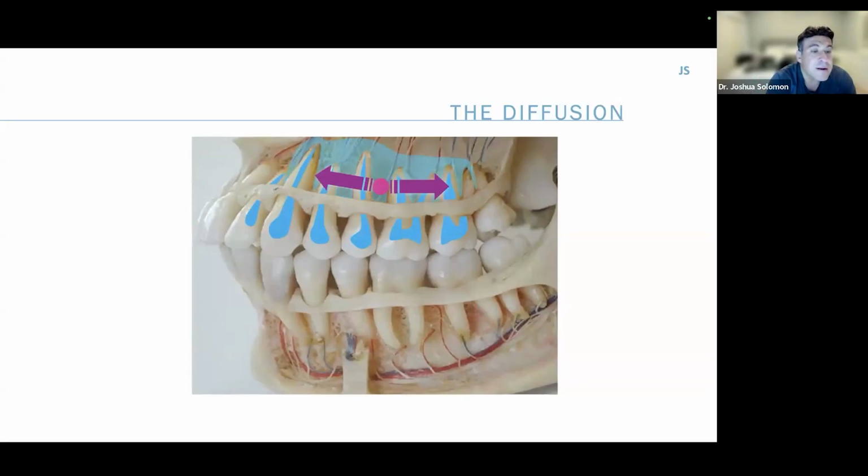Okay? So given the proper depth of needle and the proper bolus amount of local anesthesia, what we see on the upper arch is an equal number of teeth numb. In general, if you're truly into the cancellous bone, you're going to get 2 teeth distal and 2 teeth mesial. Now that I will see in primary teeth. In permanent teeth, an older patient, because the needles are not super long, they're really designed for the primary mixed dentition, I'll typically see 1 tooth mesial, 1 tooth distal. Sometimes we'll get bonus teeth, but in primary mixed dentition, I have no problem getting 2 teeth numb distally, 2 teeth mesially.